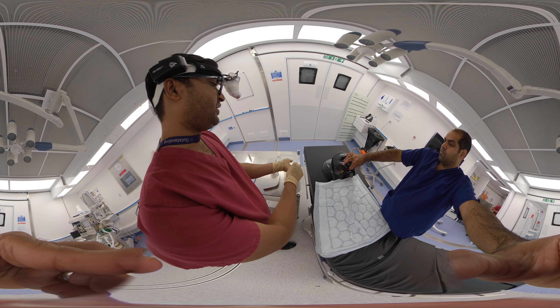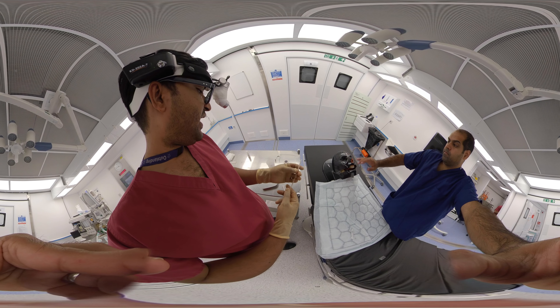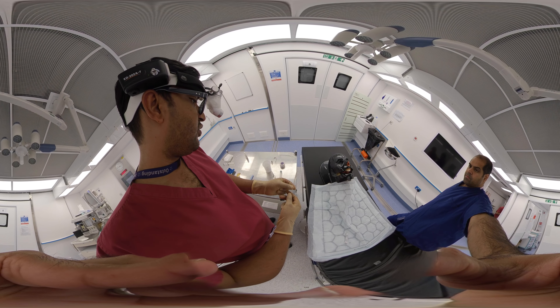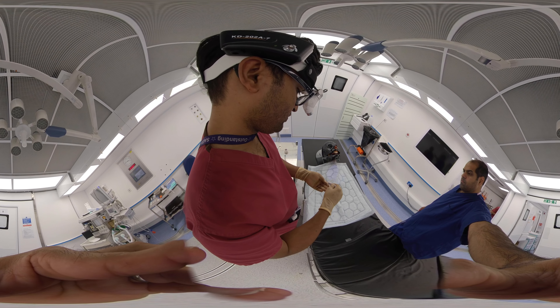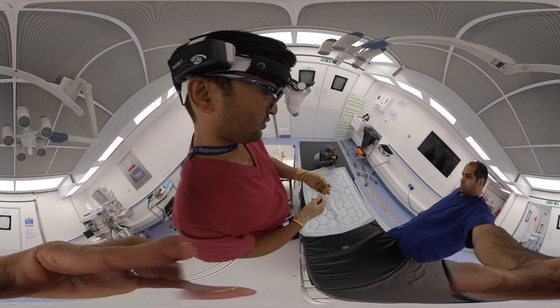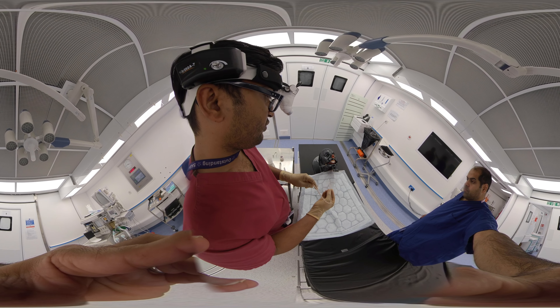First, we have to make the Foley catheter well lubricated. I had applied a generous amount of lubricant on my catheter already, so I'm applying some more now. After applying the lubricant very well, we are ready to proceed.